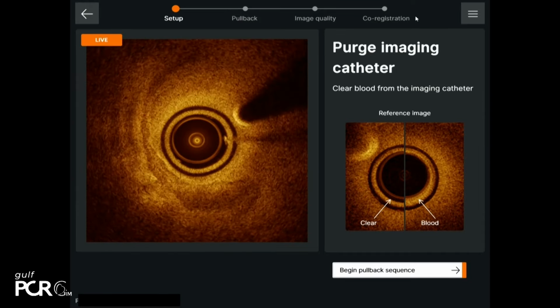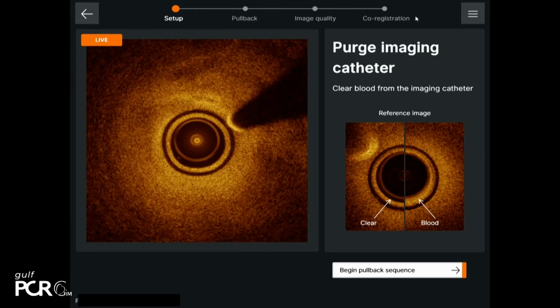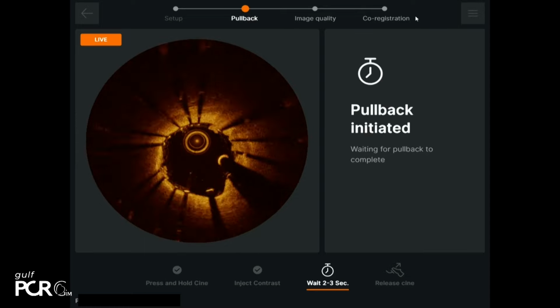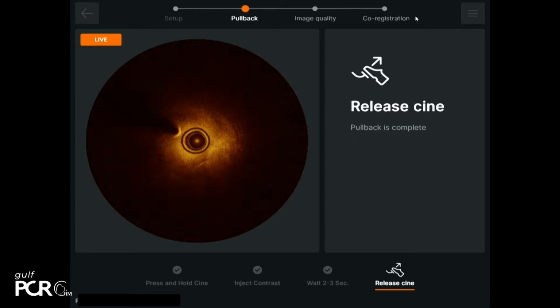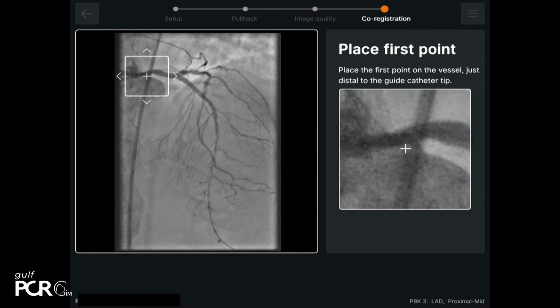Okay, just a second. Okay, ready? I'm ready. Make sure that you're engaged. Push the guide. Make sure. I checked. Okay, start cine and inject. Cine. Okay, good. Take it aside. Don't pull, please. I cannot hear anything. Could you show us the co-registration image? Okay. Yeah, sure.